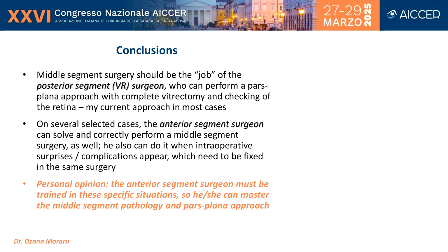As a conclusion, the middle segment surgery should be the job of the posterior segment surgeon, the VR surgeon, in my opinion, who can perform a pars plana approach with complete vitrectomy and checking of the retina. And this is my current approach in most of the cases. On several selected cases, the anterior segment surgeon can solve and correctly perform a middle segment surgery as well. He or she also can do it when intraoperative surprises and complications appear, as you saw in my last two cases, which need to be fixed in the same surgery.